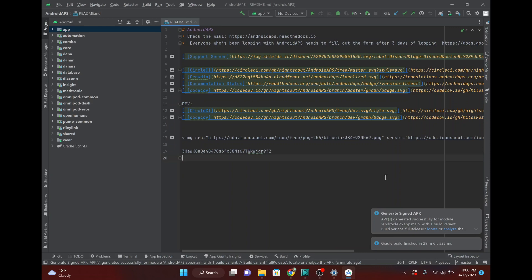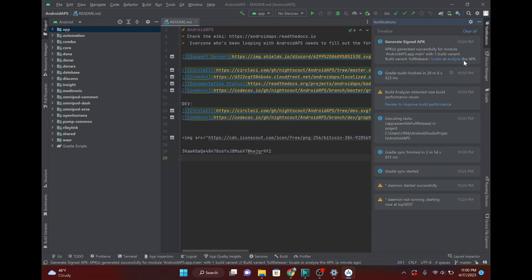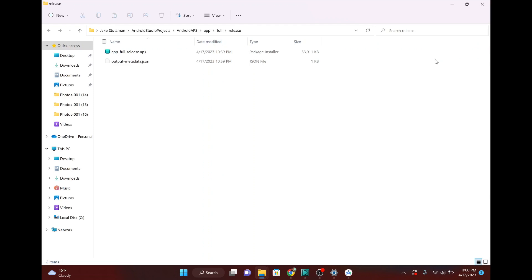Okay. Just got the notification that we were done. So, you just click here. And then you want to locate that APK that was just generated. Okay. And it's the app full release.APK.